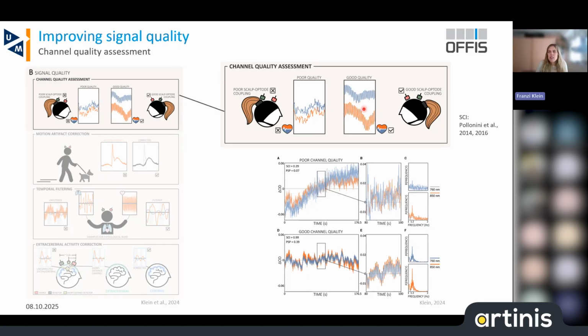But of course, you still have the option, if you have measured a participant and have only very poor data quality, to exclude it post-hoc, because you found that the data quality is very poor. But for real-time experiments this is more tricky, because if you don't check your data, then this has a direct influence on the real-time experiment, right? And this can reduce the trust in the system for the patients and so on. So it's always a good idea to check your data quality, but for real-time experiments it really is even more important because it has a direct impact.